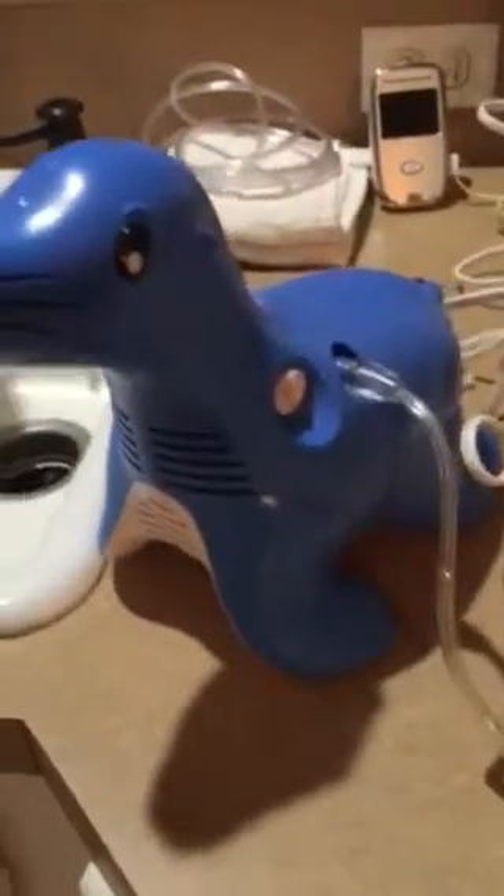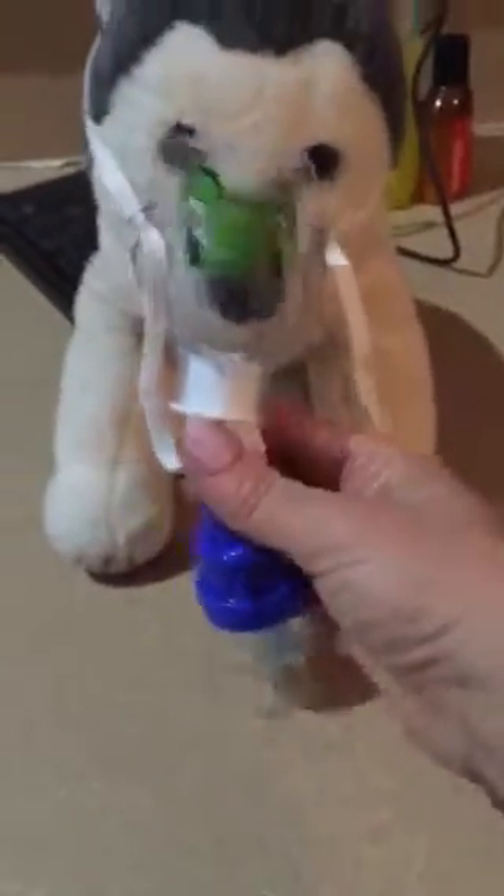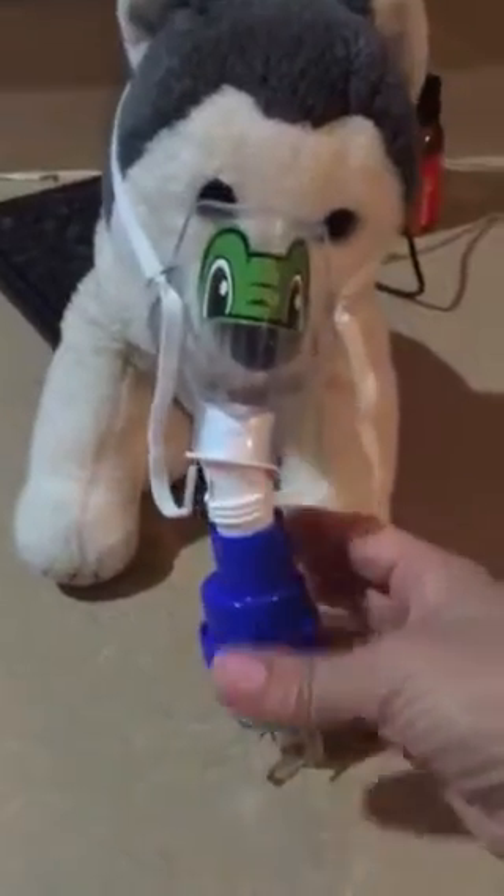Here is the nebulizer machine — I'll leave it plugged in right here. This is the mask that she'll wear; it's the actual mask that came with it. If she wants to use the turtle, you just have to pull this tube part out down here and then plug it into the bottom of this one, whichever one she wants to use.